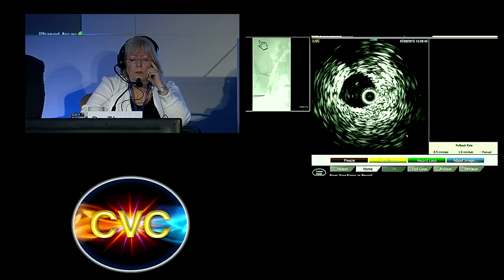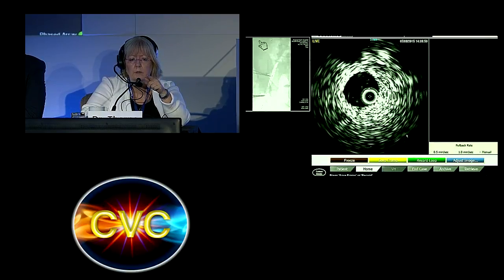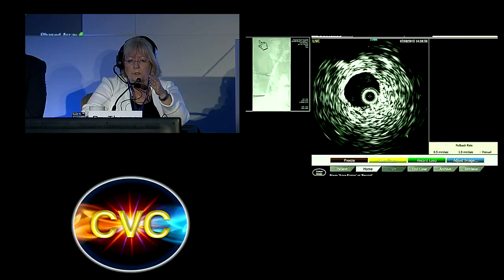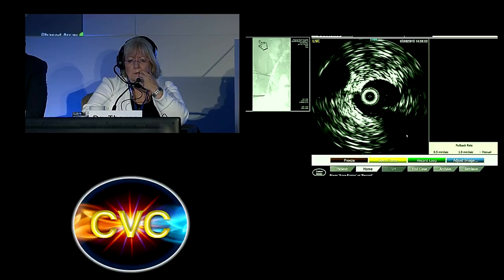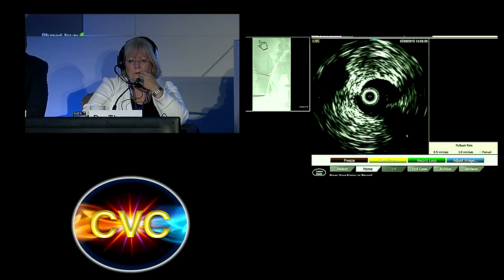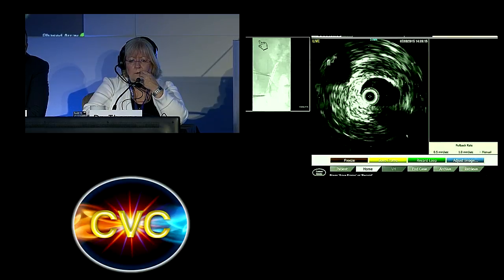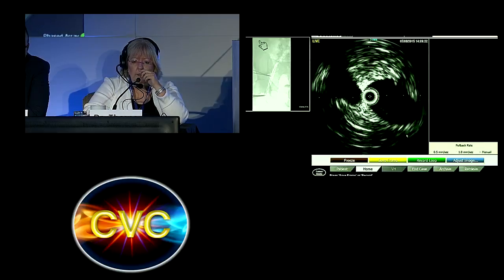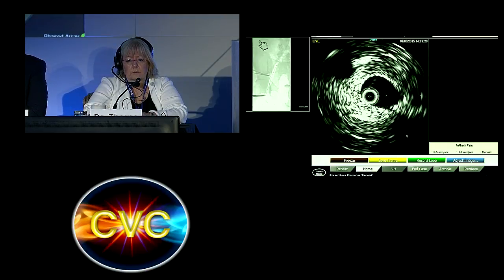Okay. What do you see right at this area here on the external? Well, I just see on the venogram the narrowing about another 6 centimeters above that, and it was concerning to me. Yeah, there's an area actually that gets... Let me just look at that live on the road map again. Right here, there's the origin of the hypogastric. I think we can see it. Perhaps in the venogram it looks smaller, but I don't think it looks diseased to me. Oh, okay. Yeah, you see that? It's the origin of the hypogastric, and maybe gives us this particular image. But by IVUS it's pretty clean.